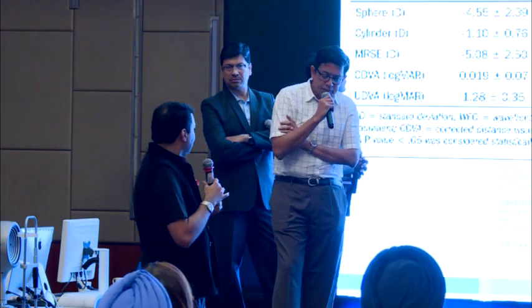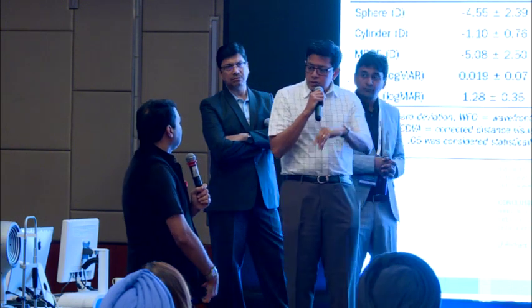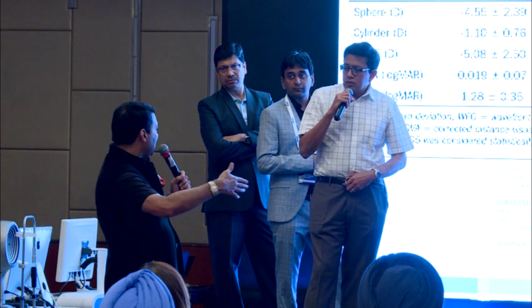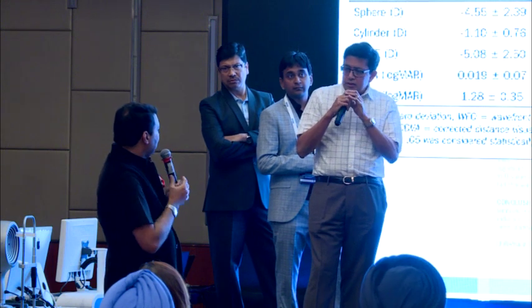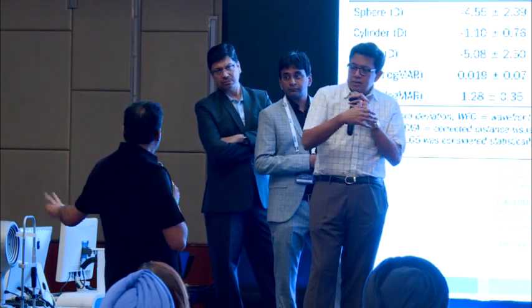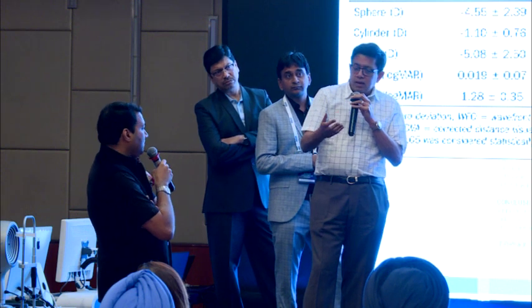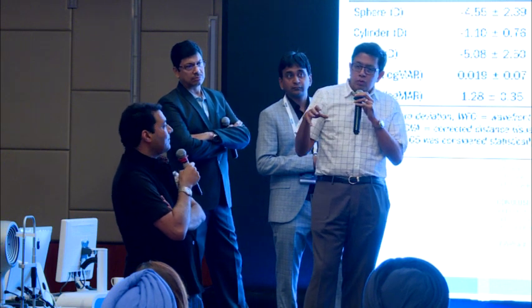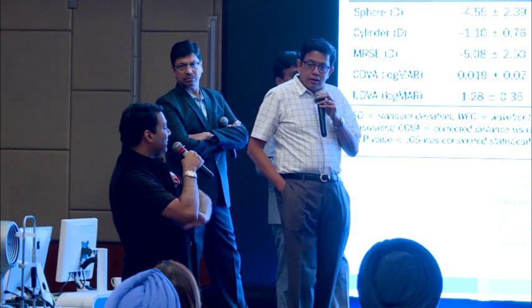I think we must have some definite guidelines as to when we switch over completely, when we don't. And I think we have something planned for this evening. Okay. No, why I'm saying is that I found some of the decisions a little arbitrary in the sense that the FDA trial did show that CONTOURA works, and they had specific limitations as to when to apply it, when not to. And if you go by those guidelines, with a difference of 1.25, 1.5, then we still have to do wavefront optimized for a lot of them.